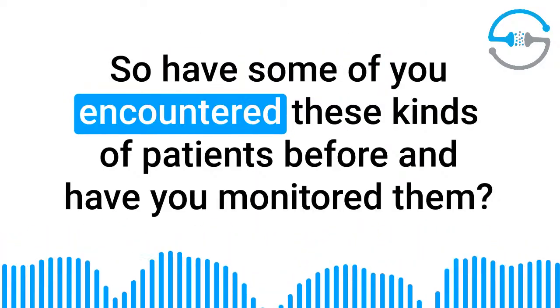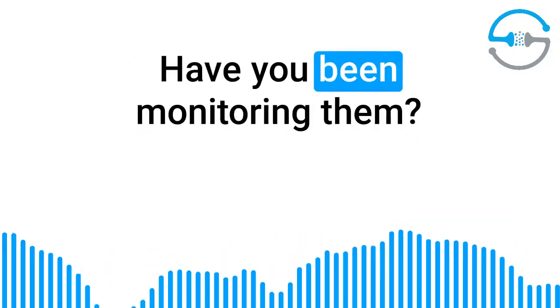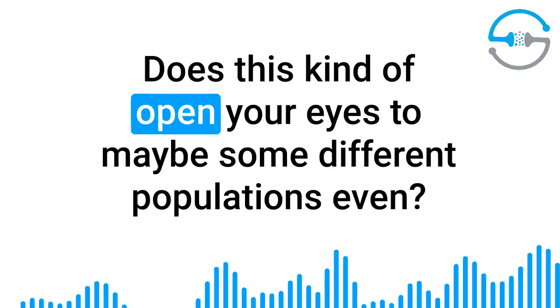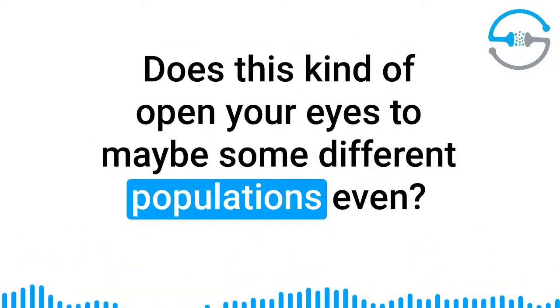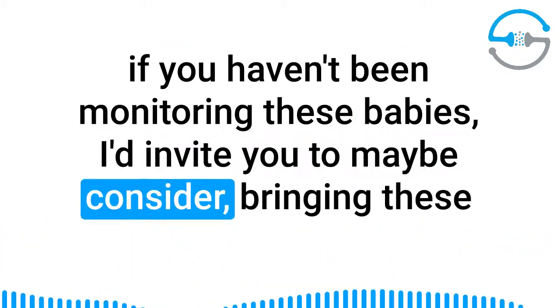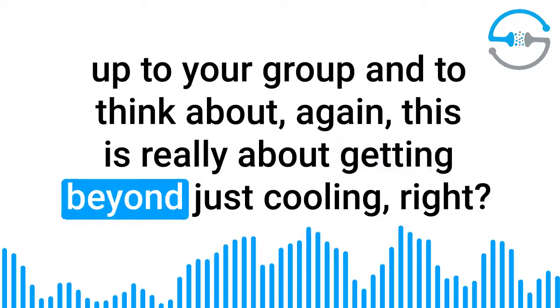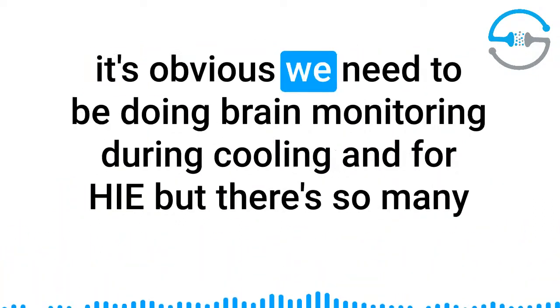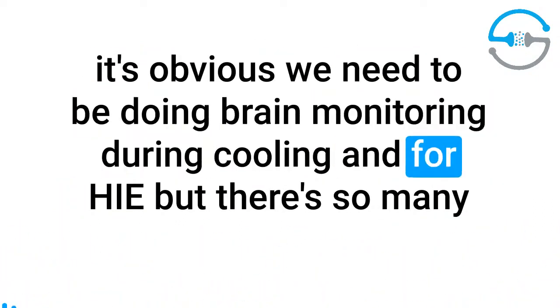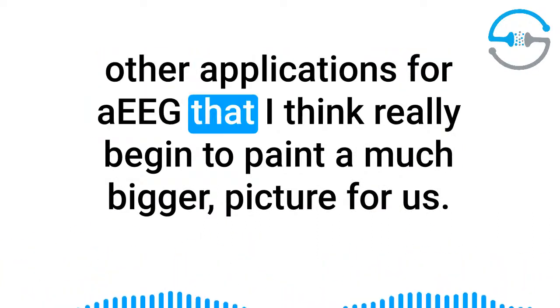So have some of you encountered these kinds of patients before? And have you monitored them? Does this kind of open your eyes to maybe some different populations even? If you haven't been monitoring these babies, I'd invite you to consider bringing this up to your group and to think about, again, this is really about getting beyond just cooling, right? It's obvious we need to be doing brain monitoring during cooling and for HIE, but there are so many other applications for aEEG that I think really begin to paint a much bigger picture for us.